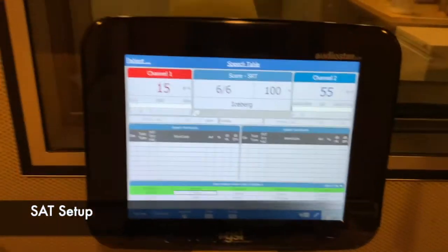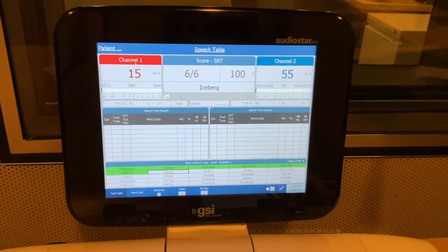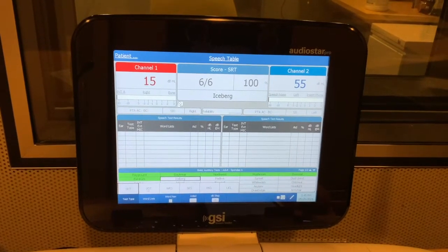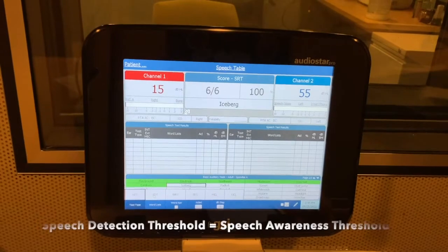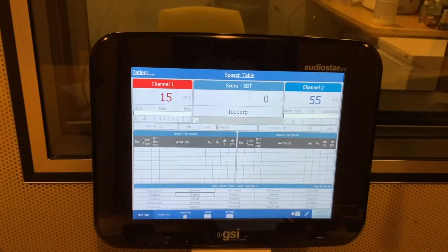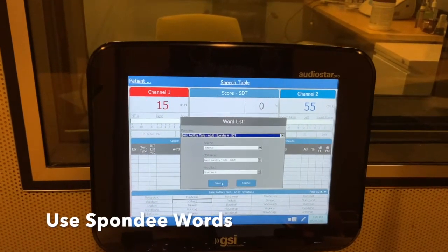So switching to speech awareness threshold, what we want to do again is take our mouse, click on test type, and do speech detection threshold. It is also called speech awareness threshold. Again, we are going to want to be using the spondee list.